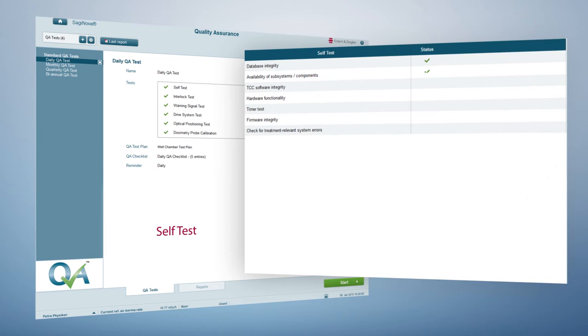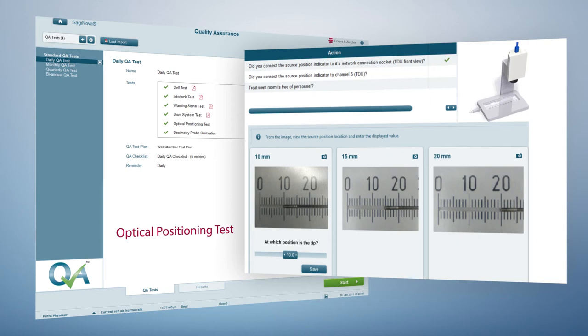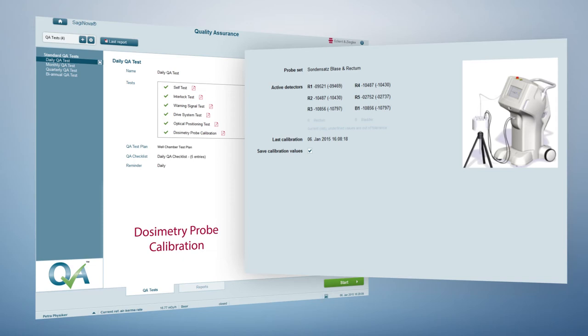Q-Assist is operated from the Saginova workstation. The highly customizable tool supports the user in adhering to highest quality assurance standards. Q-Assist tests are performed in sequence and consist of different function tests that verify whether the system and critical components are operating correctly.